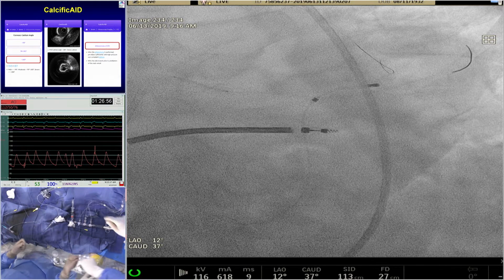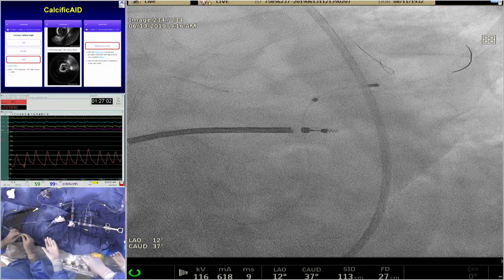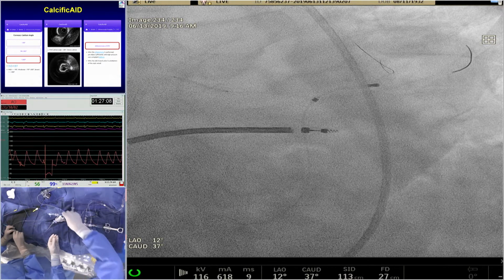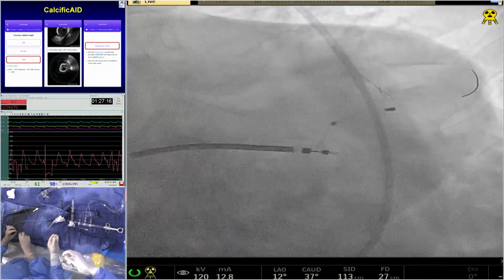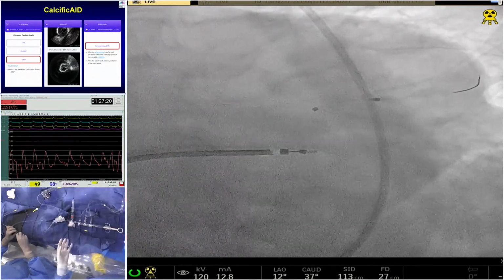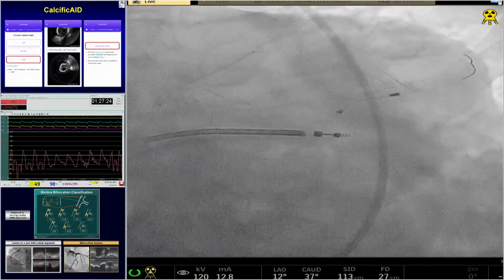For the long lesion in the circ, I don't think that can be treated with a balloon, even a drug-eluting balloon. I think the lesion in the circ is longer than the LAD, so I will stent from the ostium of the left main to the end of the lesion in the circumflex. Dr. Sharma, I probably would not have predilated the ostium of the LAD after rotablator. After that, you do a POT, you kiss with minimal protrusion of the balloon in the LAD, and you look at the result, even with IVUS. That we don't do because we cannot pay for it.